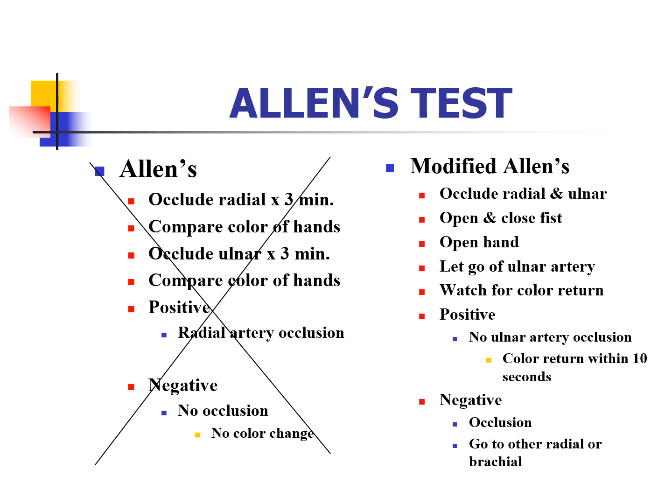Then we're going to go from the patient's right hand to the patient's left hand and do the modified Allen's on that as well. The modified Allen's test is something we always had to chart. I always did what was called the modified Allen's test, where I'd put a pulse ox on the hand that I was testing. So if you have one of those finger pulse oxes at home, put it on your finger. Try it now if you can.